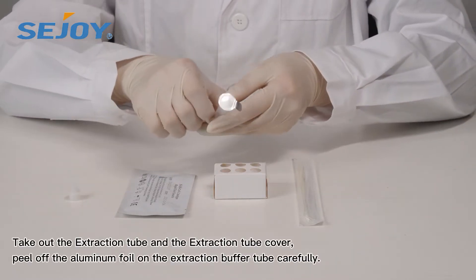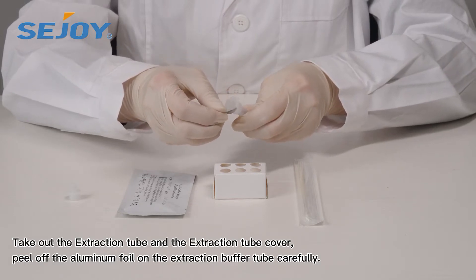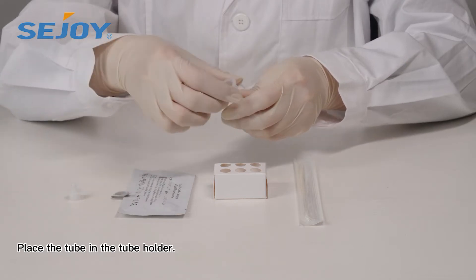Take out the extraction tube and extraction tube cover. Peel off the aluminum foil on the extraction buffer tube carefully. Place the tube in the tube holder.